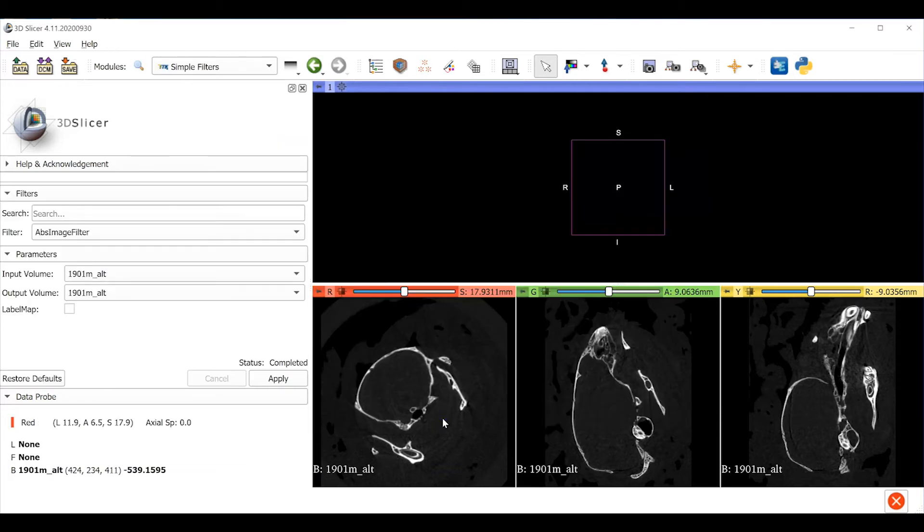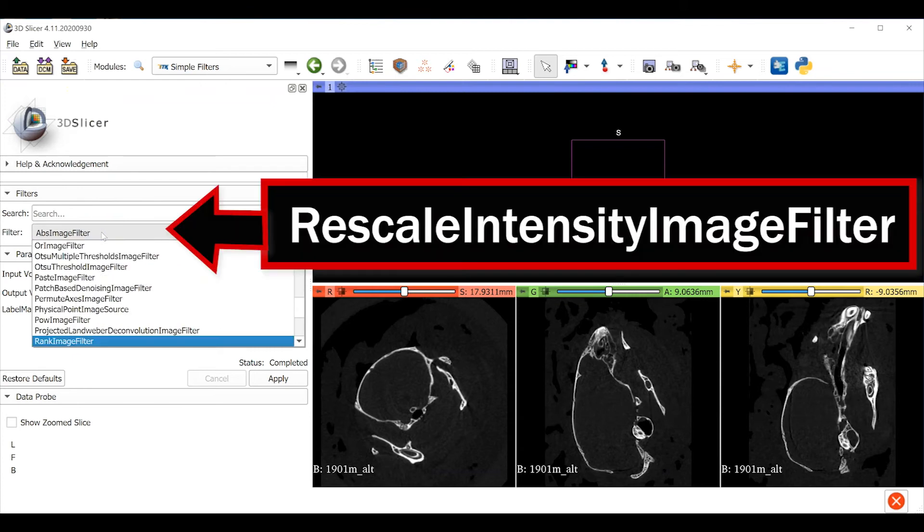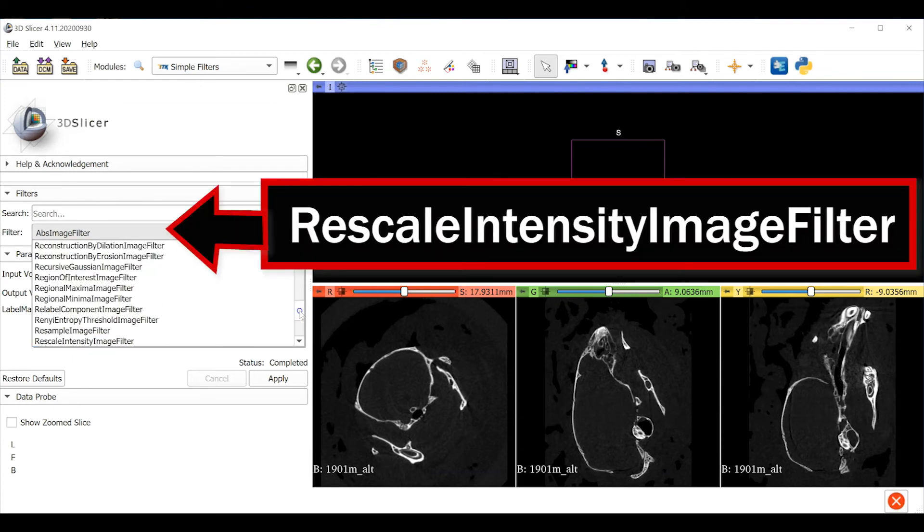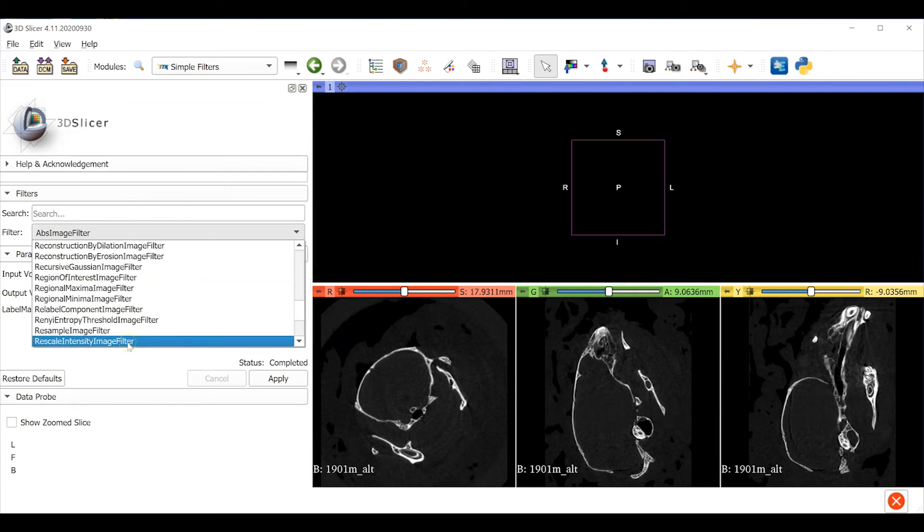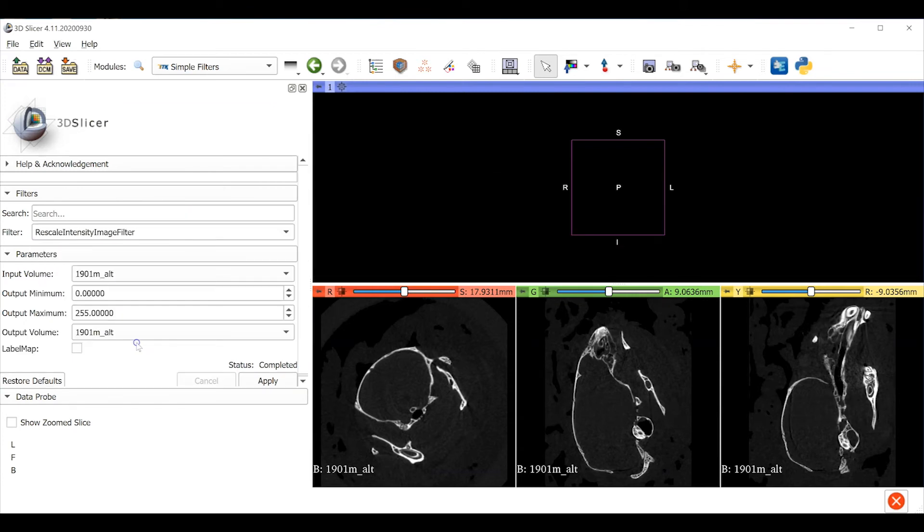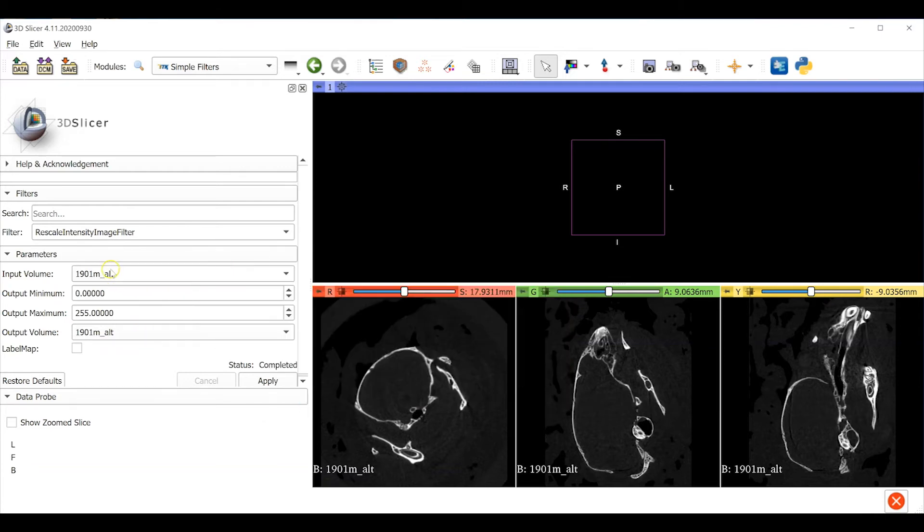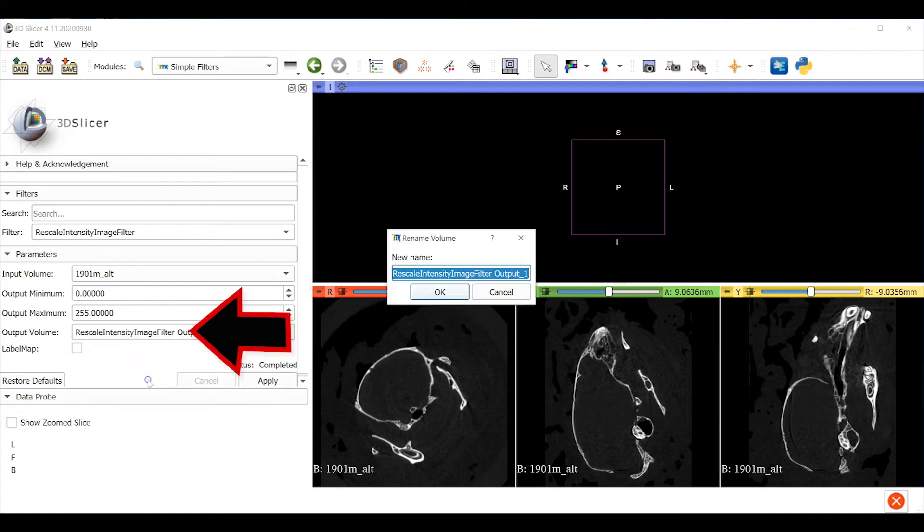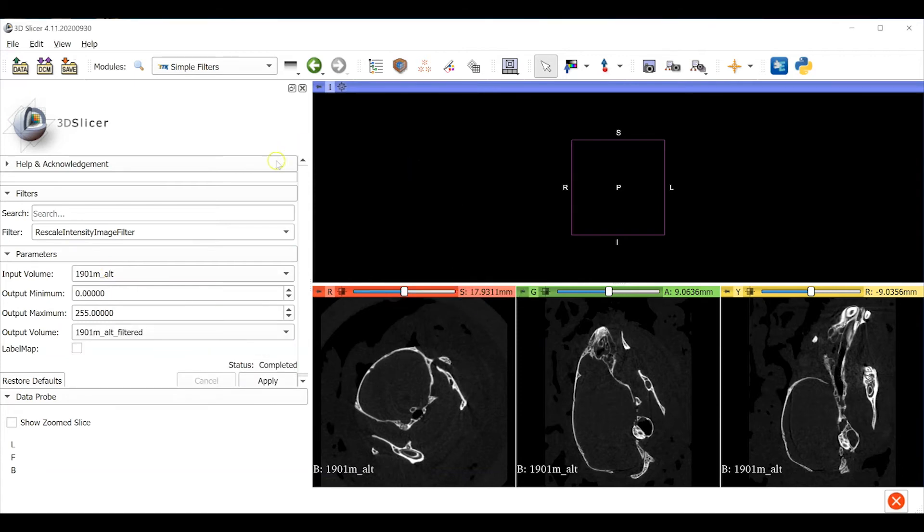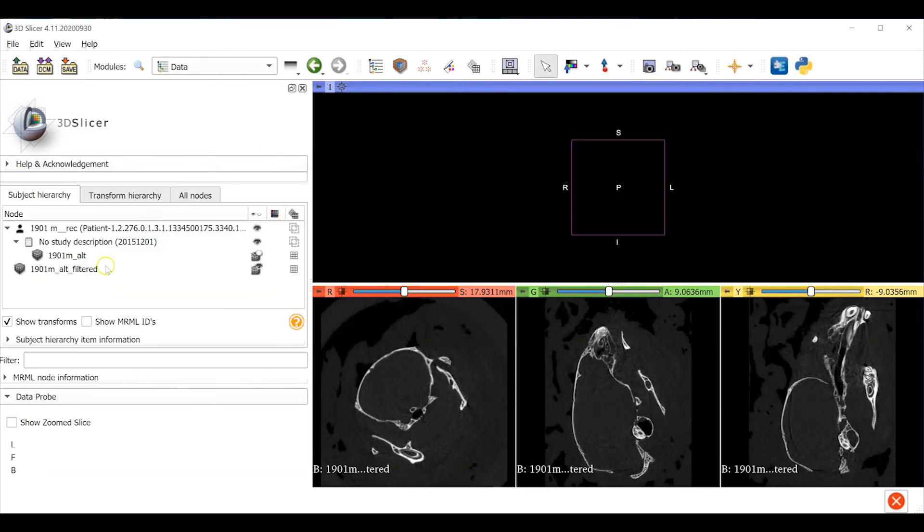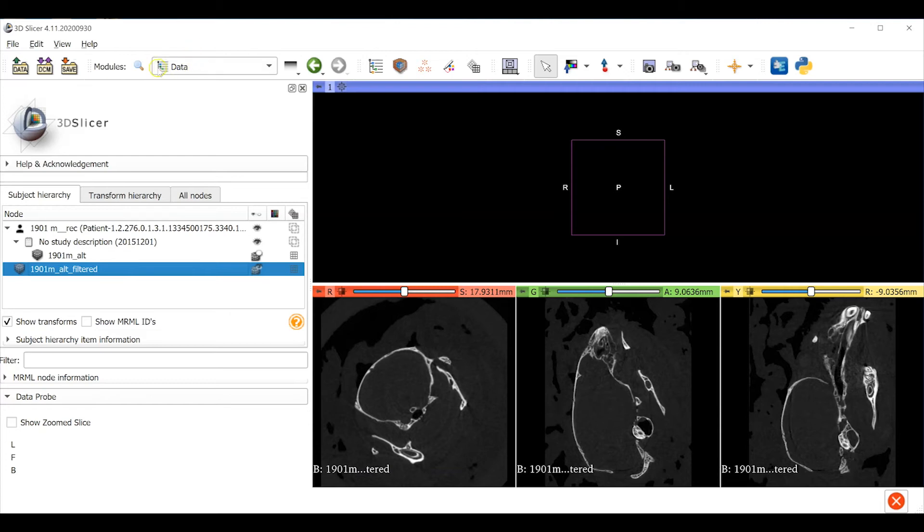Use the filter pull down menu here to find Rescale Intensity Image Filter. Set the minimum and maximum grayscale values to 0 and 255 respectively. Enter a new name for the output volume. Here I just appended the word filtered and then click apply.